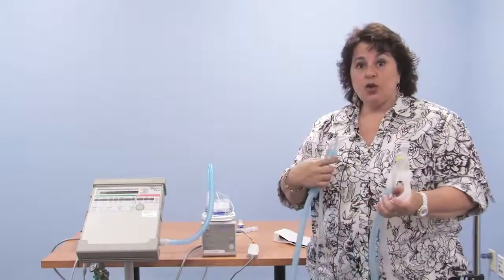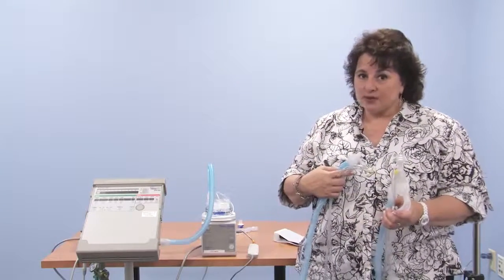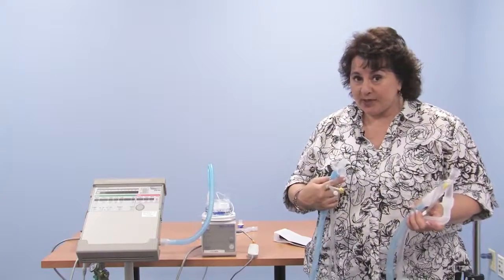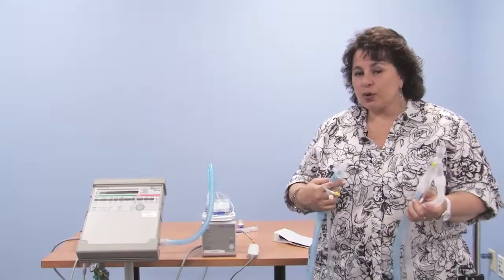So we want humidity to the tracheostomy tube. This is different than the cool mist trach collar that you might have seen, that your child might have used at one point in time. This is humidity like in the air, in the clouds before it rains.